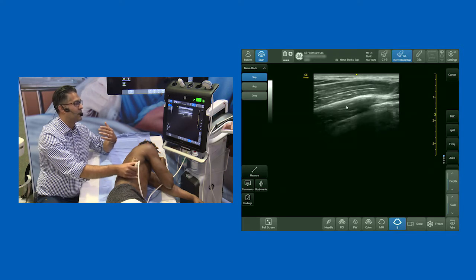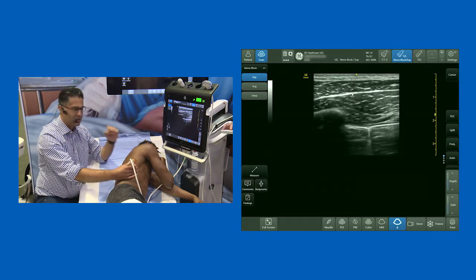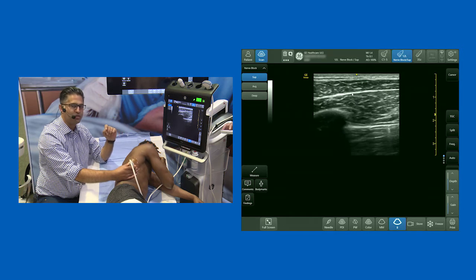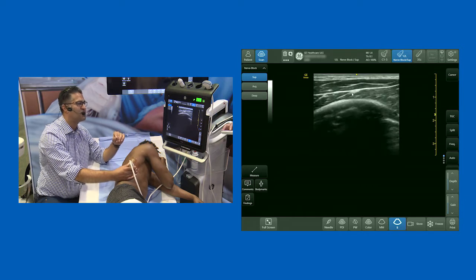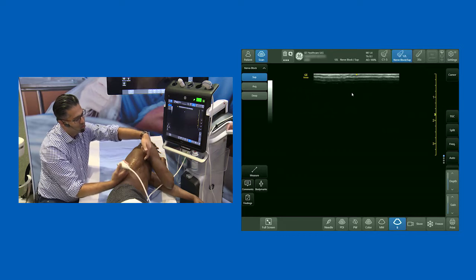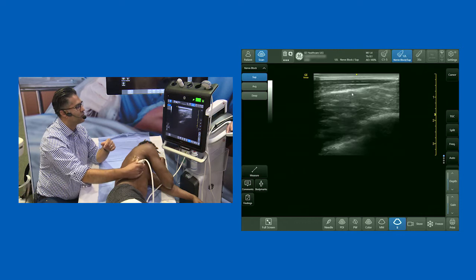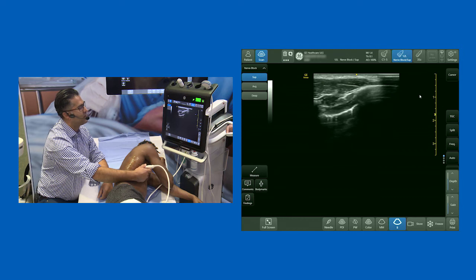Given a choice, I would rather place my local anesthetic above the serratus muscle. It's a nice place to thread a catheter and you can open it out really beautifully. For breast surgery, if I can't do a central neuraxial block but want to really get the lateral cutaneous branches, I would rather attack the serratus plane laterally. If you've got it in the pec-two position you're bringing a needle down and visualizing an anterior slip of serratus, but going around that serratus you can see how it comes to an end, and you don't always get a beautiful slip of serratus there.